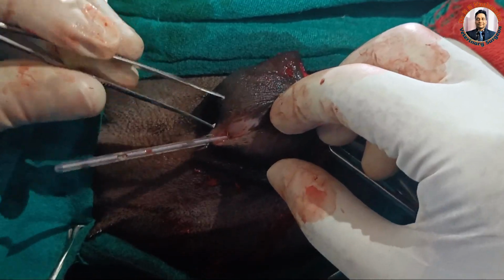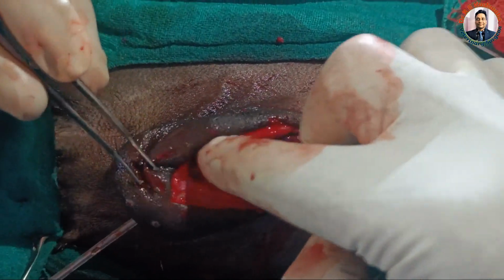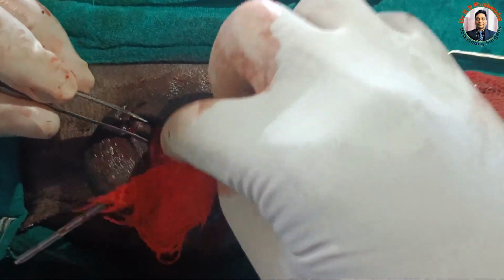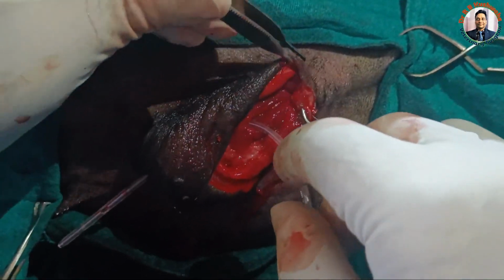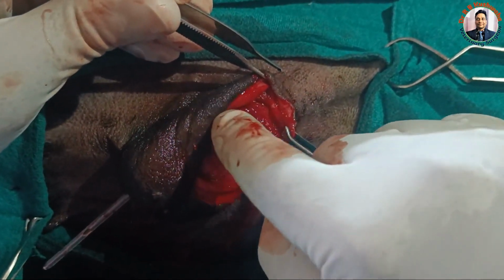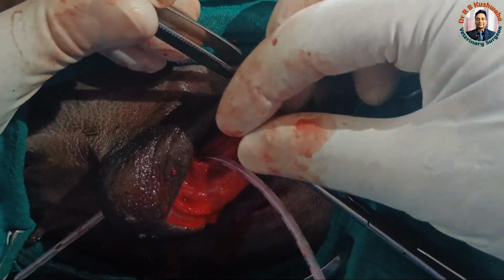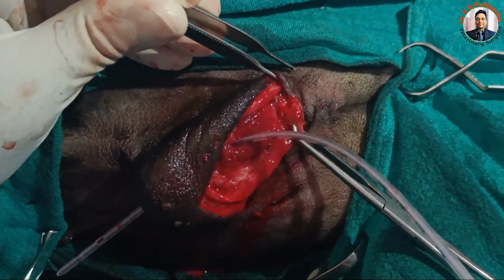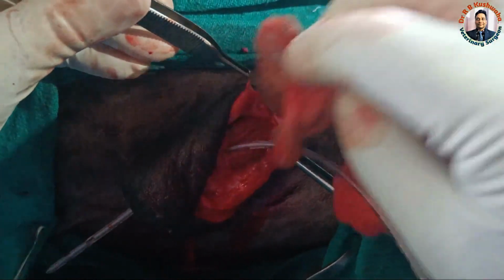So this is the prepucial cavity, and this distension at the ventral prepuce is because of the accumulation of urine in a large portion or diverticulum of the urethra. Now in the next step, we pass the catheter here caudally and cranially, and then we make an incision here to make a strip of the urethra, and then we unite that urethra, and the rest of the mucosa will be removed. So in the next step, we are going to perform the urethroplasty.